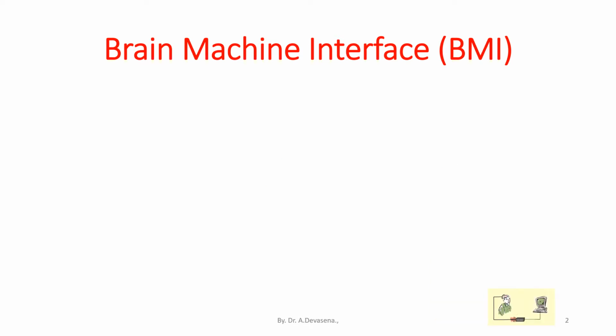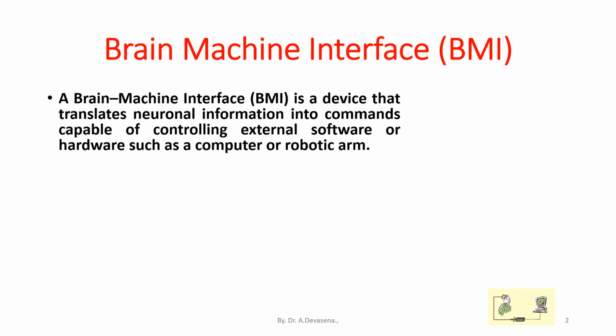Brain-machine interface (BMI). A brain-machine interface is a device that translates neuronal information into commands capable of controlling external software or hardware such as a computer or robotic arm.